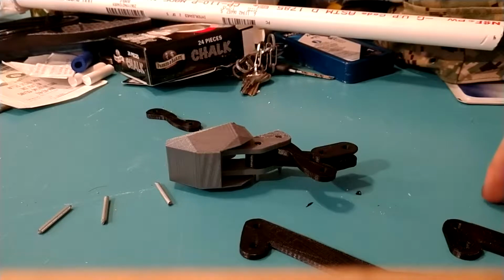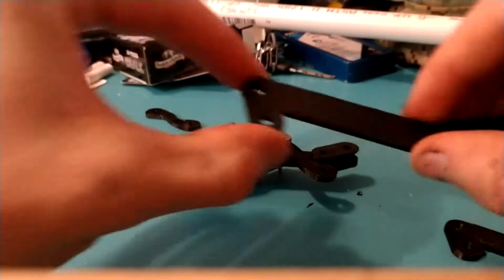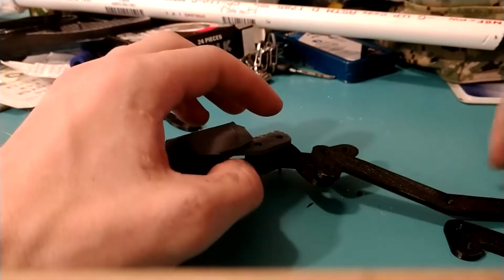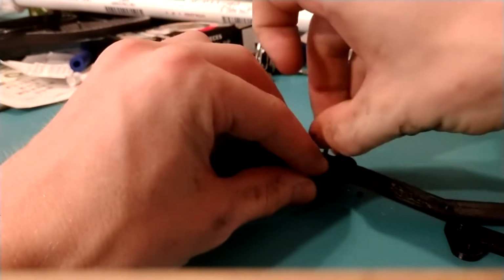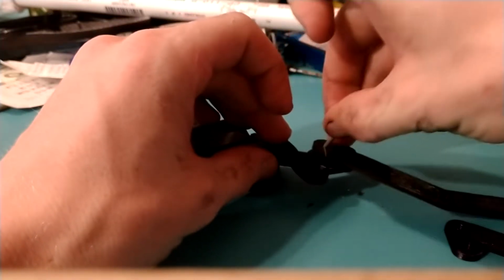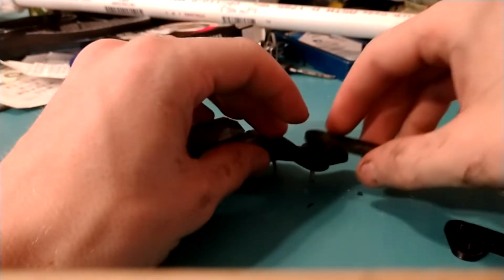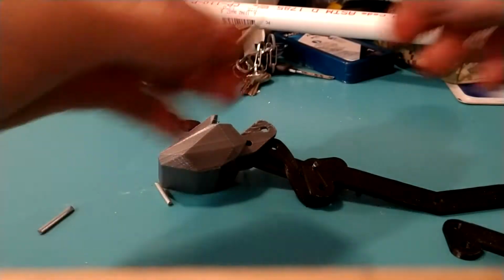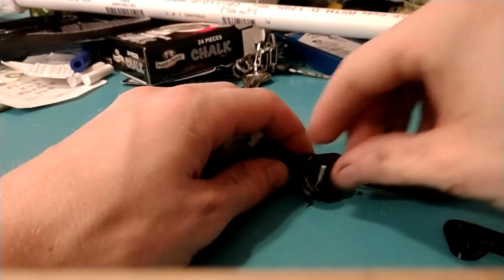Now, the next thing you're going to do is these pieces. These pieces are going to connect to both the front of the finger. It's going to connect those last two pieces together with pins. Now, like I said, it's all temporary, so it's falling apart. I'll show you a finished one after this.